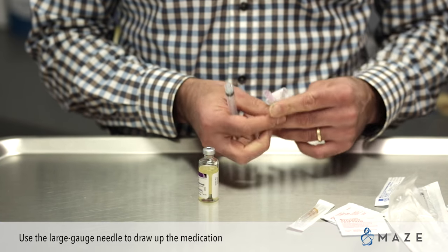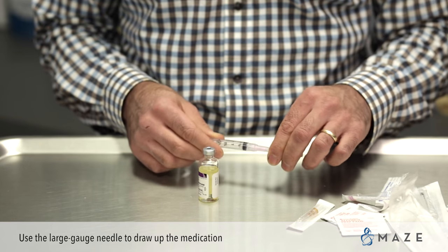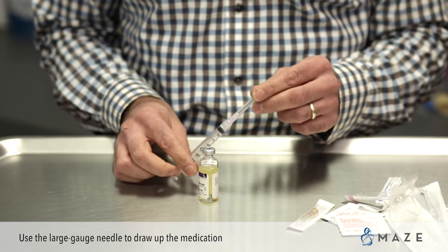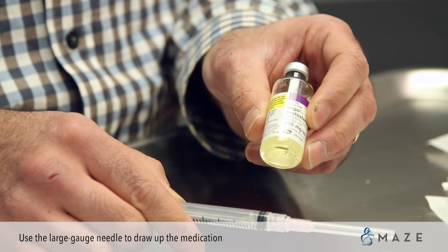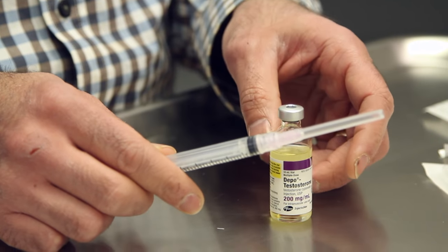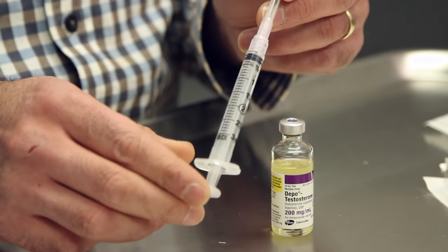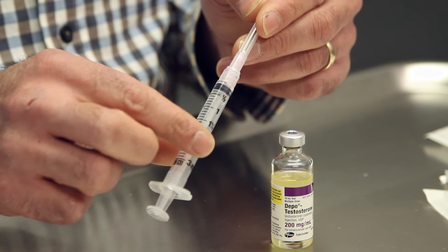We use a large gauged needle to draw up the medication from the bottle of testosterone. The reason for the large gauge needle is that the bottle of testosterone is oil-based, or viscous, and in order to ease the time to draw it out, we use a larger gauged needle. This should come with a needle already on it.